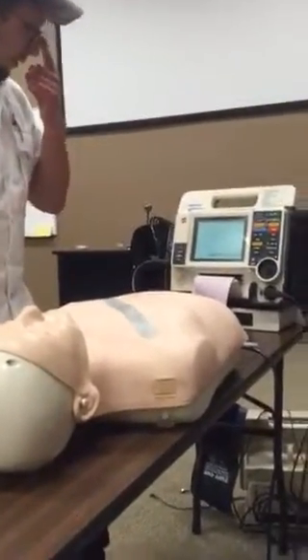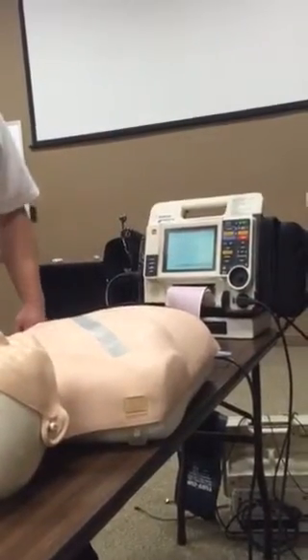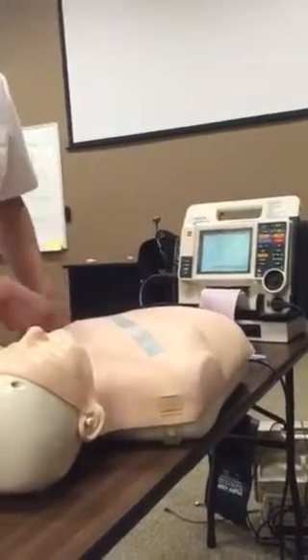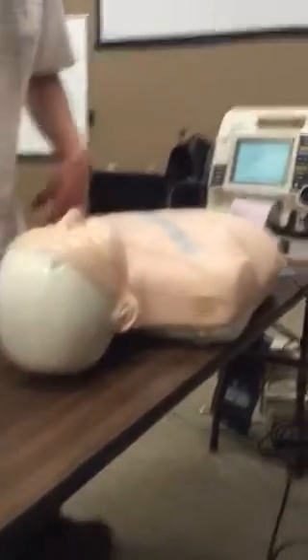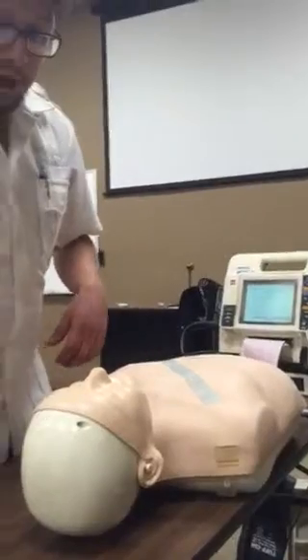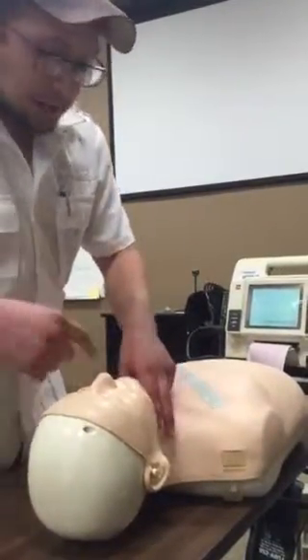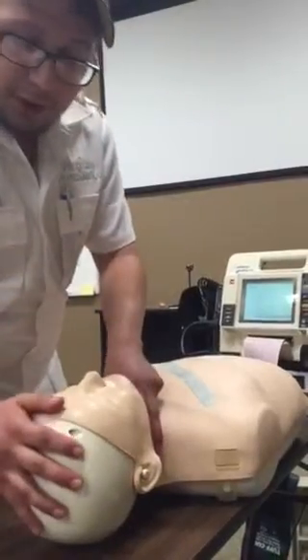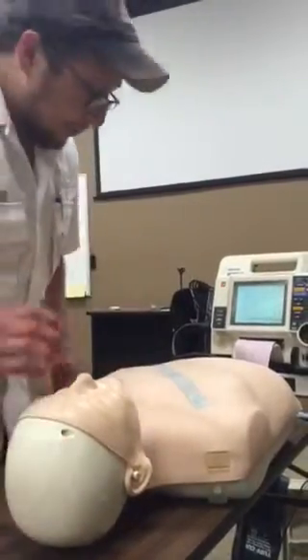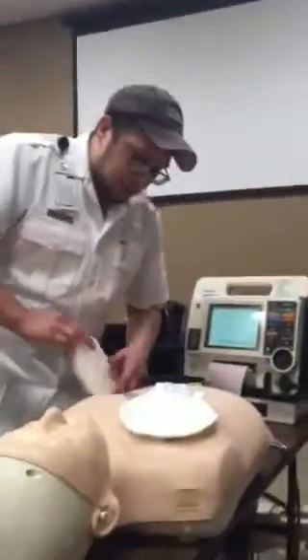Right as soon as you asked her that question, she became real pale and fell to the ground. Okay, is my patient responsive or anything like that? She is unresponsive. Okay, is my patient breathing? She is not breathing. Yeah, I'm gonna go ahead and have my partner start CPR. I'm gonna have my partner get an airway. I'm gonna have my partner stop CPR and check for a pulse. You do not have a pulse. Okay, my partner's gonna continue CPR while I grab my patches. Put the patches on my patient.